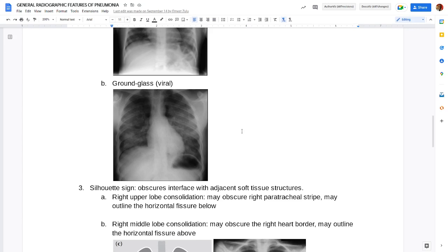If you went to the net and Googled ground glass appearance, this terminology is adopted from a certain type of glass, usually used in bathrooms, where light comes through but anyone viewing through that window will not be able to see anything.